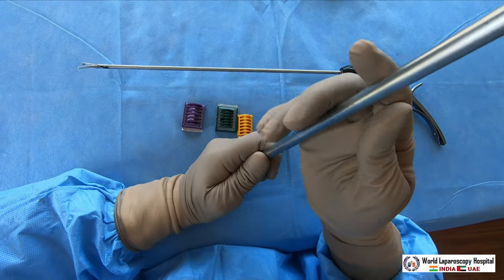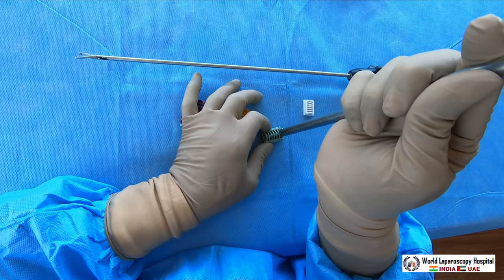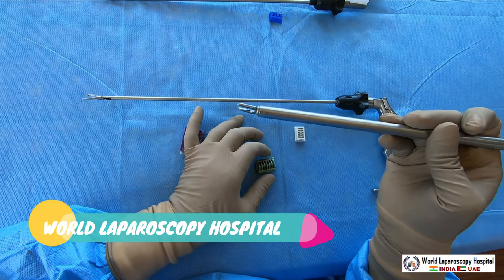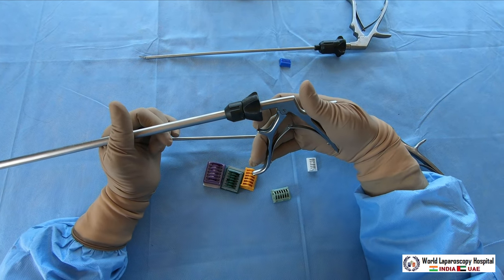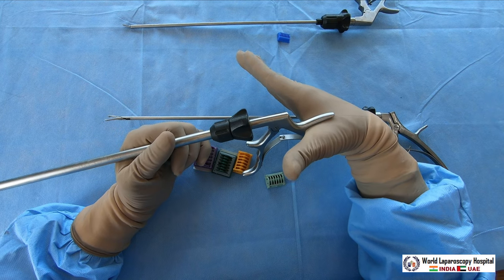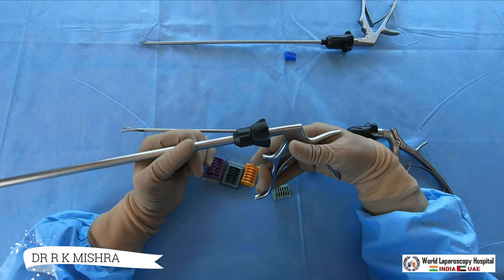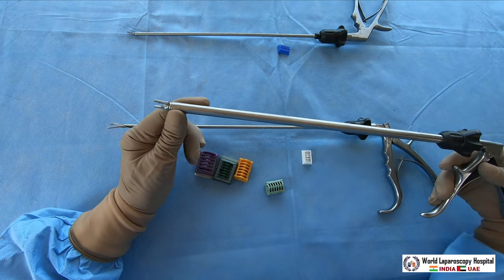To load it, you press the cartridge down onto a hard surface, press it by hand, and the clip is loaded. After that, any structure you want to clip, you just press it and that structure will be nicely clipped. When holding it, the thumb goes here, the middle finger here, the index finger is to rotate the wheel, and the gap between the thumb and the instrument rests against your hand. This rest is important so that when you press it you don't accidentally pull the handle — because pulling the handle halfway may dislodge the clip and it could drop somewhere in the abdomen.